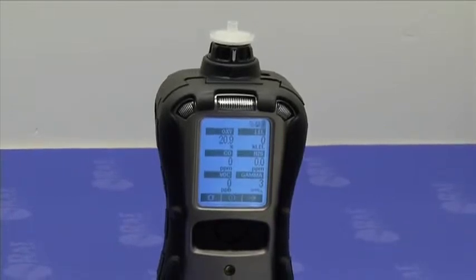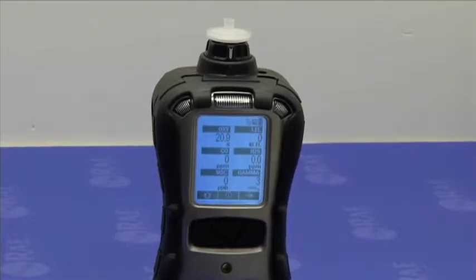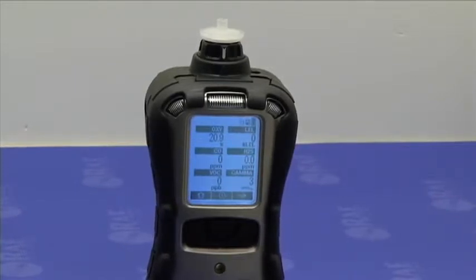The fresh air calibration process on the multi-ray can be performed in two ways. You can fresh air calibrate all the sensors simultaneously, or you can calibrate individual sensors. There is also an option for the instrument to prompt you for a zero calibration every time it starts.